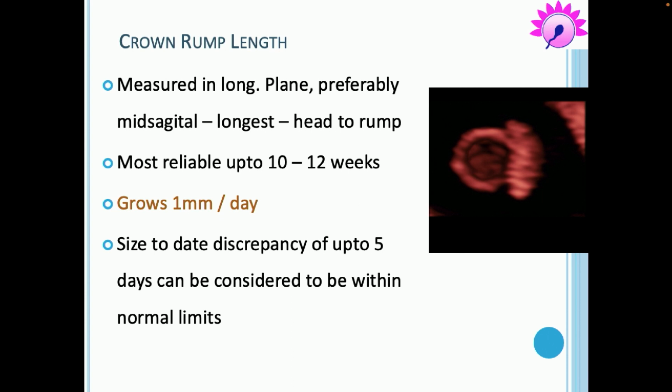It is very important for me to tell you here that whenever we are talking about the abnormal prognosis of the pregnancy, you should not depend on the days after the last menstrual period, or the weeks. You should always follow the size of the gestational sac. That is important in the early pregnancy, because not in all cases the cycles may be regular, and not in all cases the pregnancy might have occurred at the same time, the 14th day or 17th day.